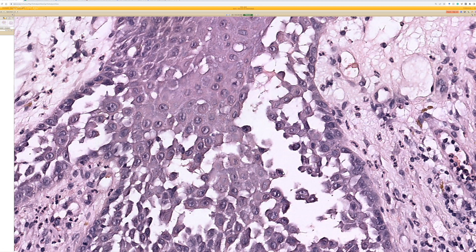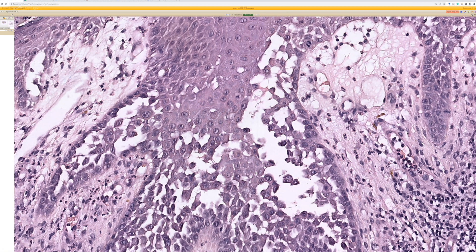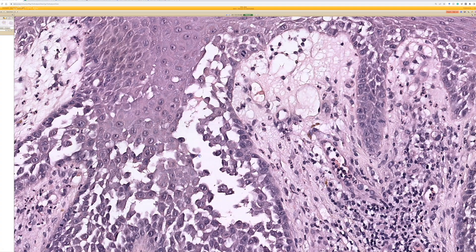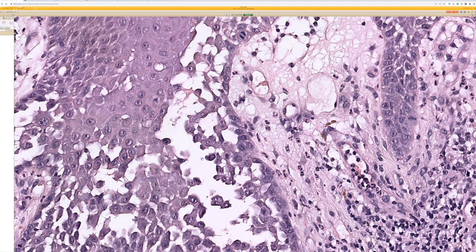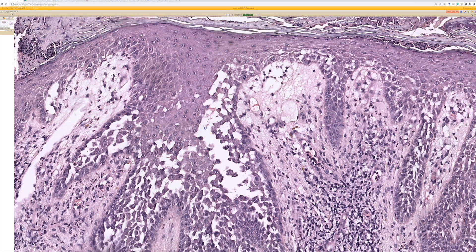Acantholysis combined with dyskeratosis brings to mind warty dyskeratoma, as discussed earlier, Grover's disease, Darier's disease, and others. But when we see acantholysis usually without the rounded dyskeratosis, we think of Hailey-Hailey disease, which is what this is.